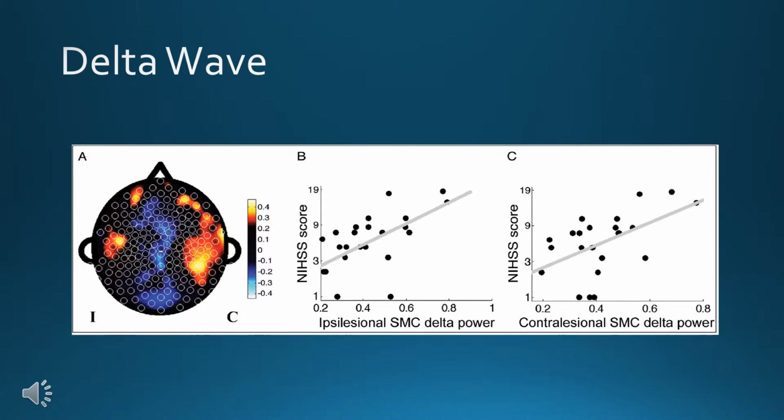This is the delta wave data collected by the EEG and then processed by the PLS model. In part A, you see a person as if they are lying on their back with you at their head. The triangle on the top represents the person's nose, and the semicircles on each side represents the person's ears. If you look closely, you see smaller circles on part A that represent the electrodes of the EEG using a saline net. The black in this picture indicates the areas that have no impairments according to the methods.